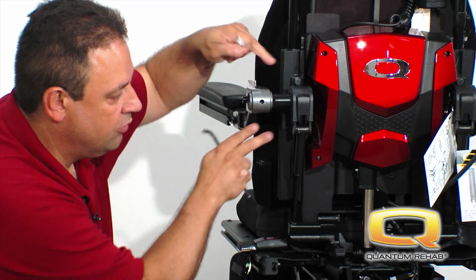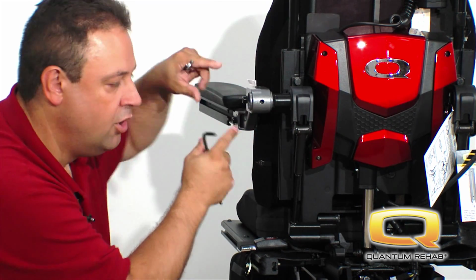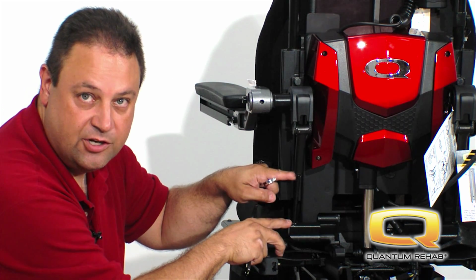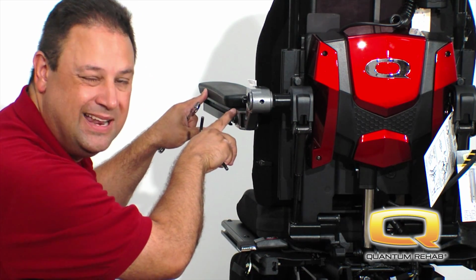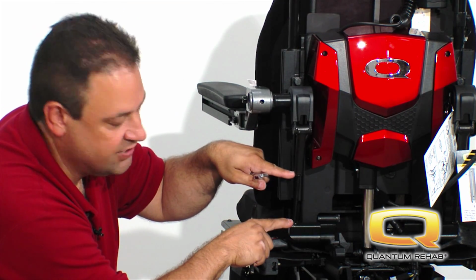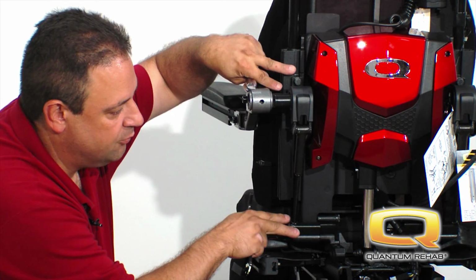If you only loosen your pillow block assembly and then try to slide the arm up and down, all you're doing is changing the arm angle. You're not affecting arm height. If you only loosen the bolts here and adjust the turnbuckle, again, you're only adjusting the angle of the arm, not doing arm height. To do arm height adjustment, you must loosen these two bolts here and these two bolts here together. And the thing you will do is loosen the four bolts.